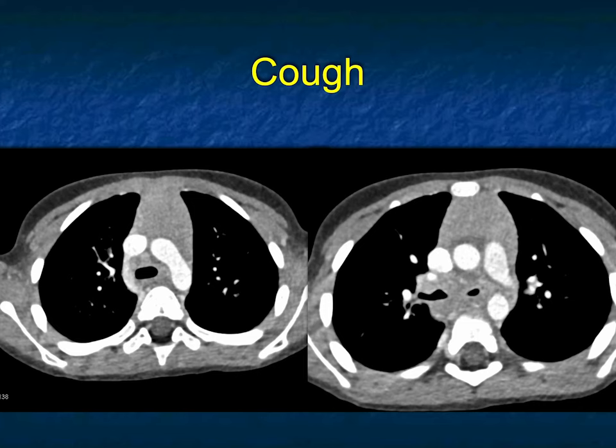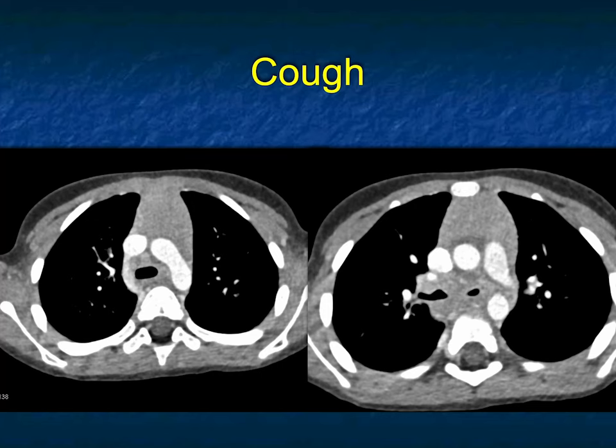This patient, a 10-year-old, had a cough. There's a prominent thymus, which would be normal for age. What's not okay for age is the extensive adenopathy in the pretracheal and retrotracheal space, extending down and beginning to narrow the airway — particularly look at the left main stem bronchus. For a child you're not initially thinking malignancy, though metastatic Wilms' tumor or lymphoma with bulky disease narrowing the airway are possibilities.